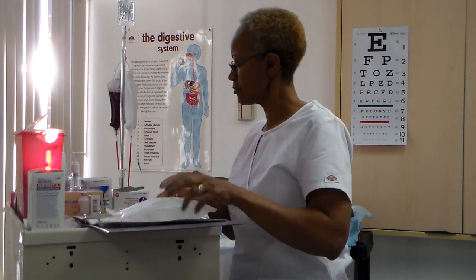Adding medications to intravenous fluid containers. Check accuracy and completeness of each medication administration record or computer printout with prescriber's original medication order. Check client's name and medication name, dosage, route, and time for administration. Recopy or reprint any portion of MAR that is difficult to read.